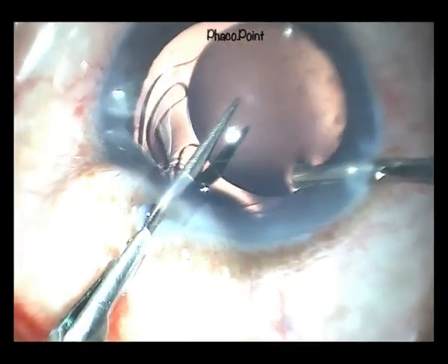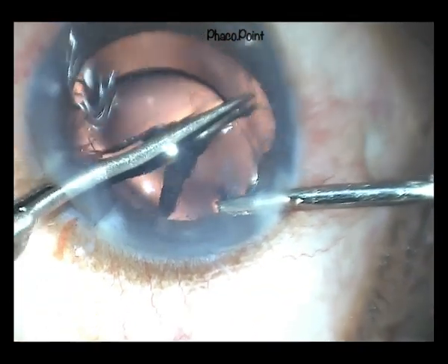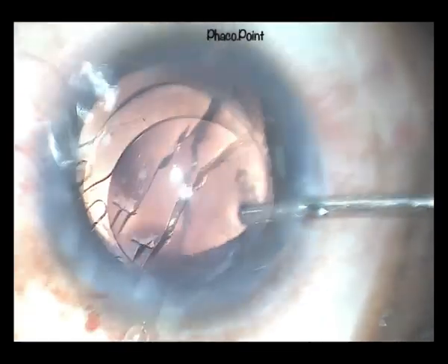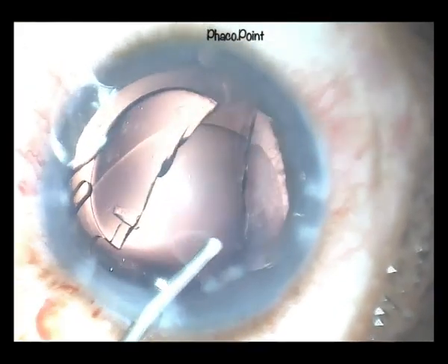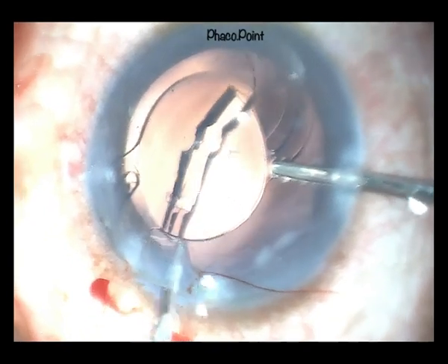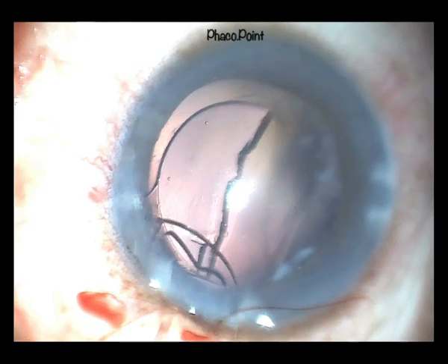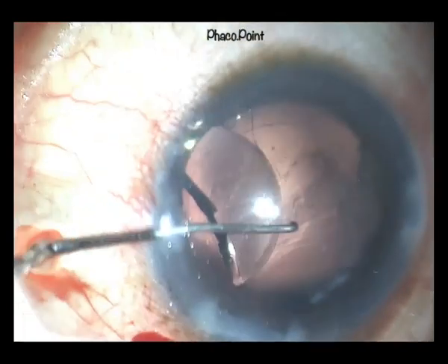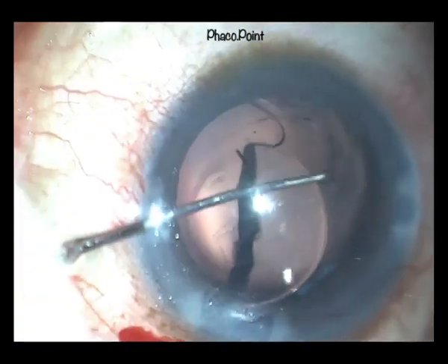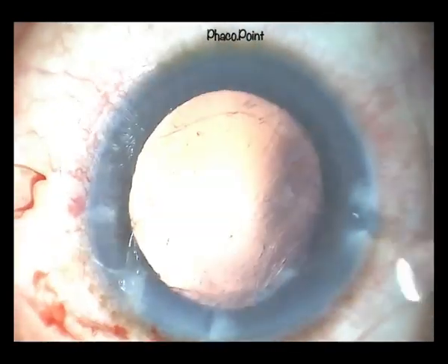The IOL, once stabilised with the help of strong forceps, is cut from the inner superior optic-haptic junction all the way through to the opposite inner end of the optic-haptic junction, and is therefore bisected into two almost equal halves. Each of the two bisected halves is rotated to come to lie in line with the incision and is carefully removed through the main incision.